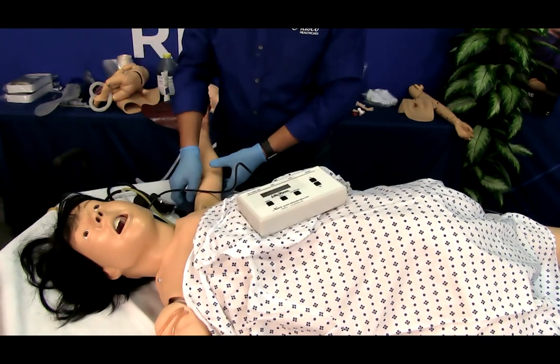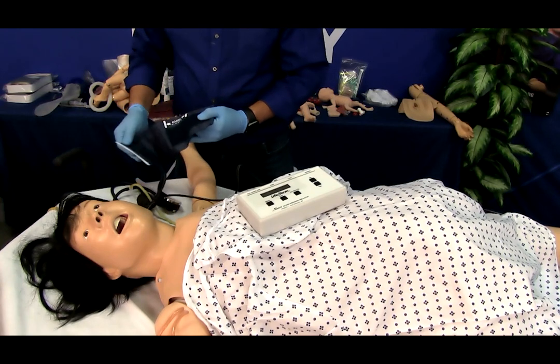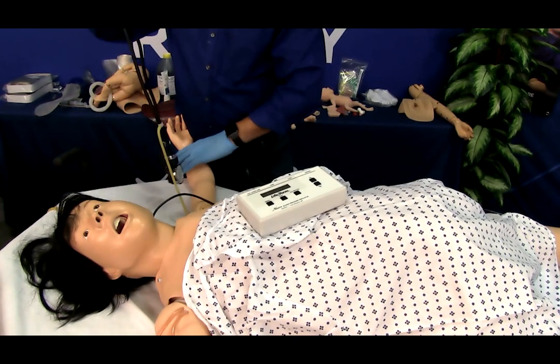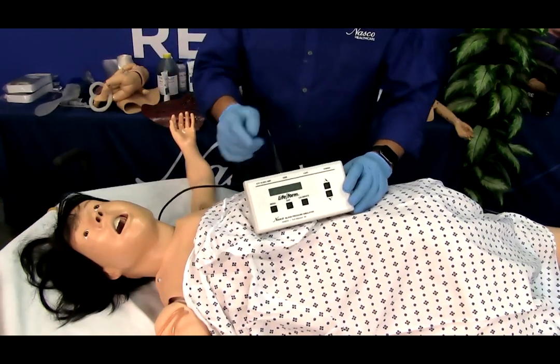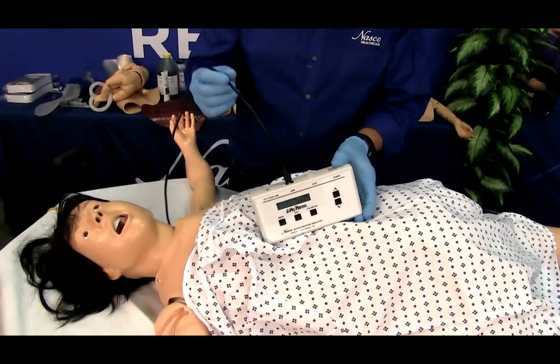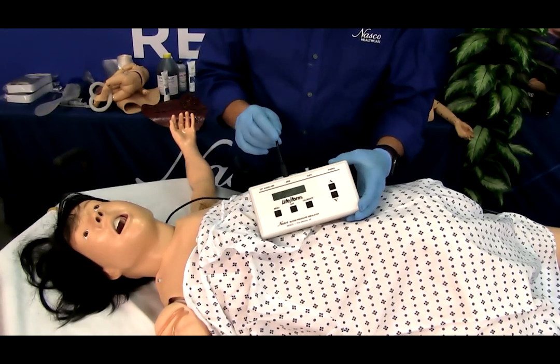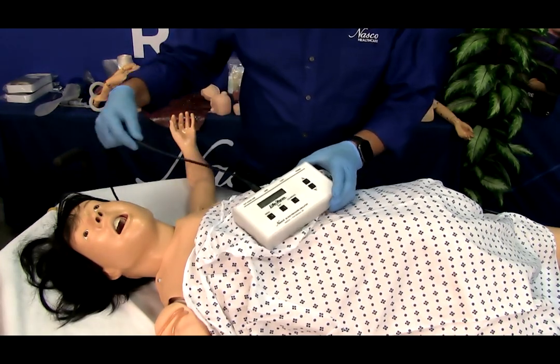To connect the arm electronic control unit and blood pressure cuff, locate the cable that extends from the blood pressure simulator arm and plug into the top of the electronic control unit using the jack labeled ARM. Locate the end of the pressure line attached to the blood pressure cuff that is assembled with a male luer fitting.